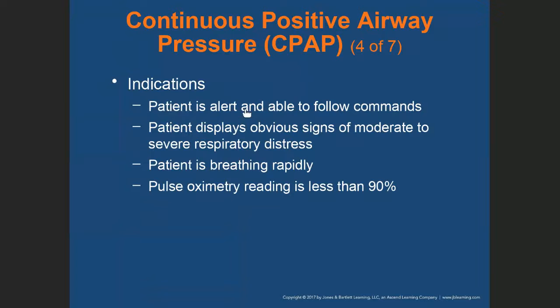Indication: the patient must be alert and able to follow commands. The patient must be showing signs of moderate to severe respiratory distress. The patient is breathing rapidly. The pulse oximetry reading is less than 90%.